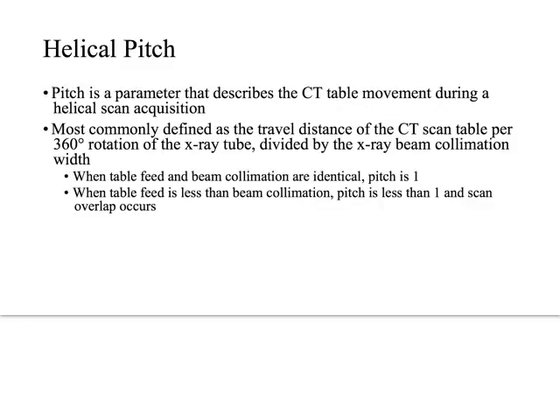A couple of things that you can kind of gloss over here real quick is the discussion of single row detector systems on page 45. We don't need to think about single row detector systems. No one's doing that anymore.